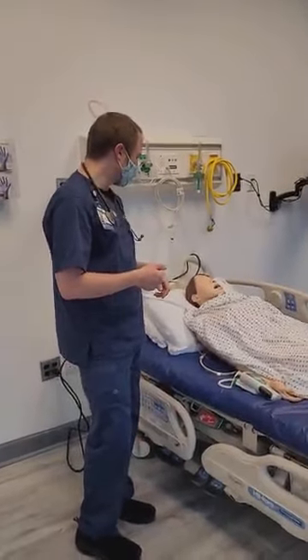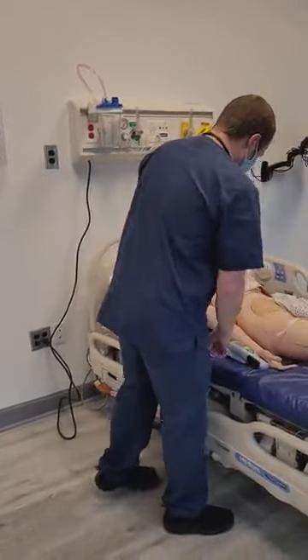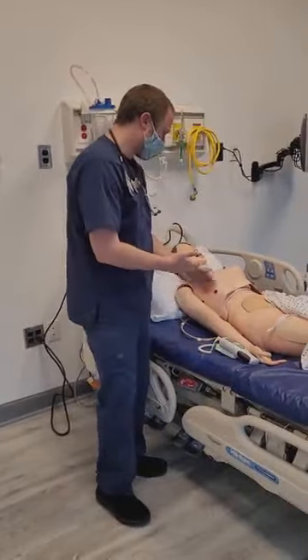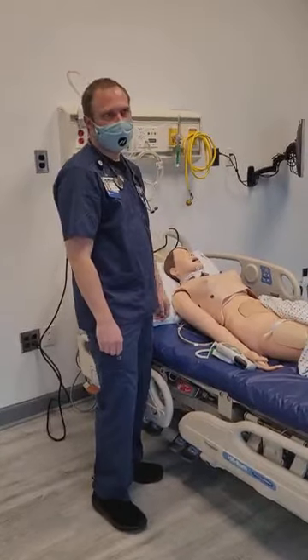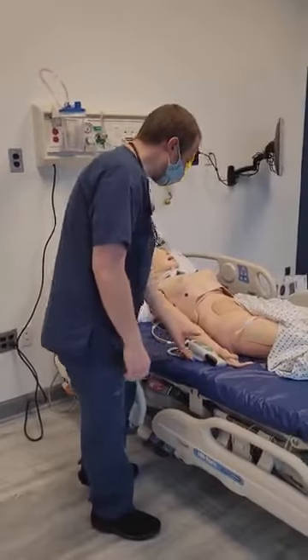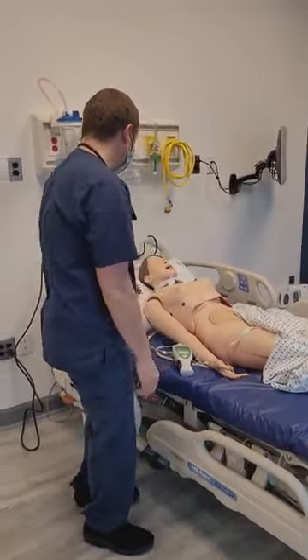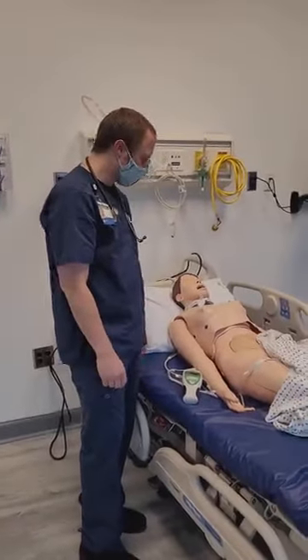And then I'm going to start with vitals. I'm going to start with taking their blood pressure. Let's say it's 118 over 68, which should be normal. I'm going to check the patient's temperature. Let's say it's 98.6, which is normal.